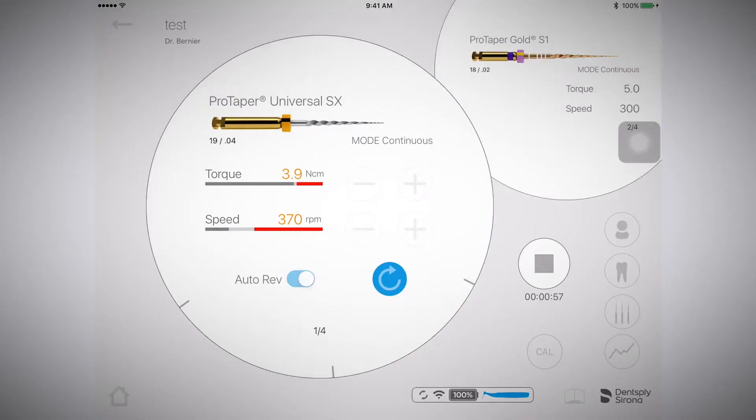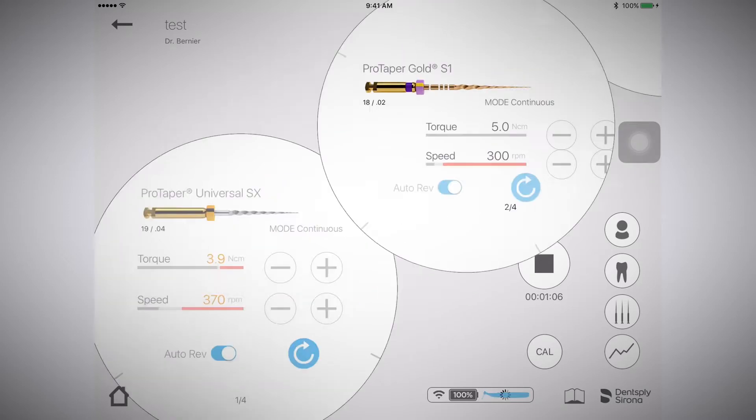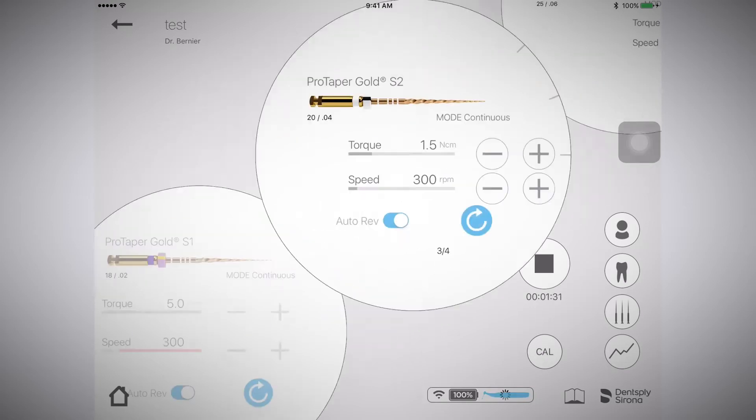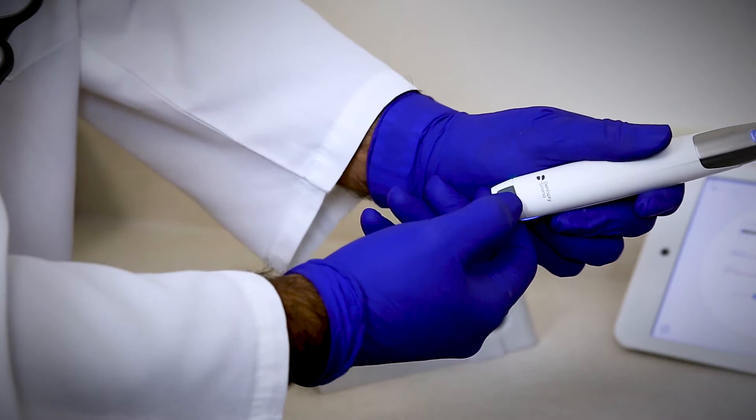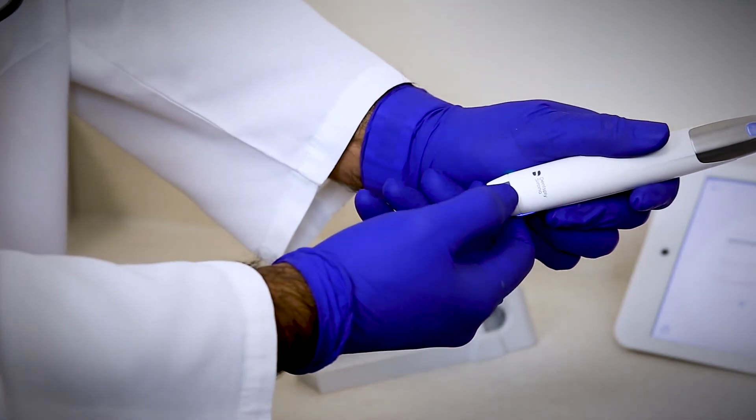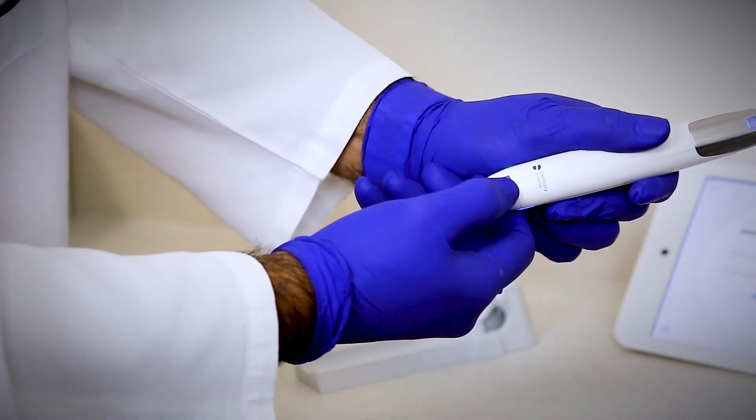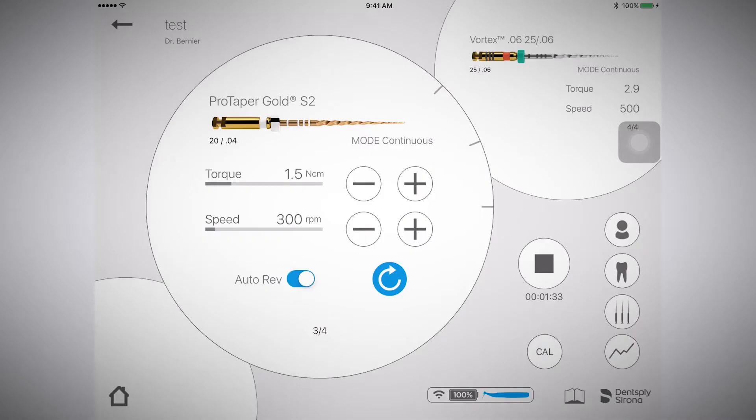When I'm done with this particular instrument, I can simply move forward in my file sequence to my next instrument. I can do this by swiping to the next file within the app or pressing the multi-function button on the motor handpiece to move to the next instrument.